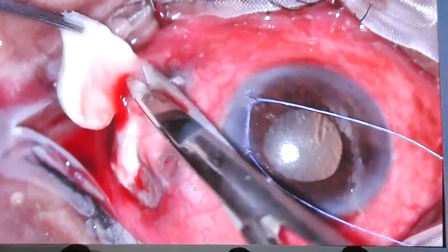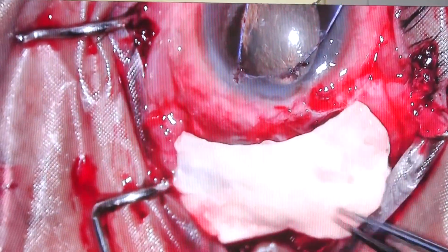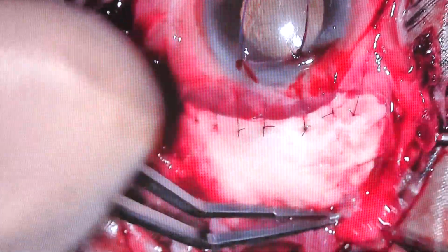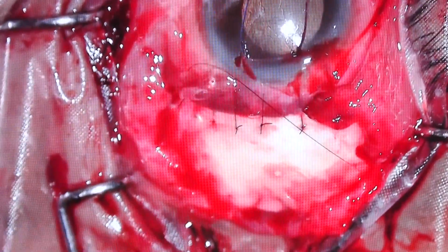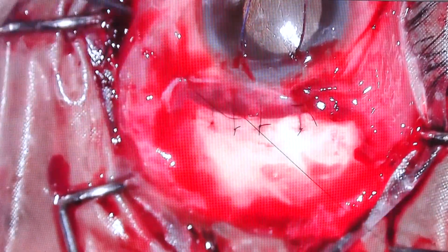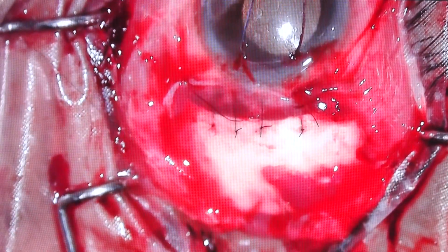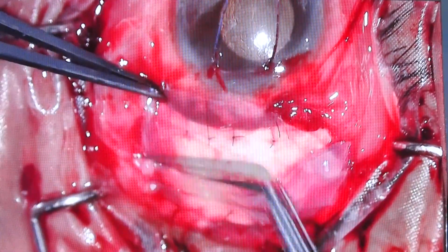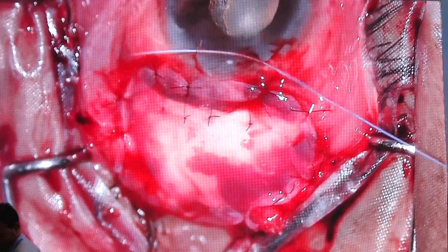The previous graft was actually stuck on, so that had to be removed, and then this graft was placed. There was quite a large defect and the surrounding sclera was also quite thin, so I could not really rotate the sutures, and I thought that a single layer amniotic membrane would not be enough. So a second layer was put and a tarsorrhaphy was done after that.